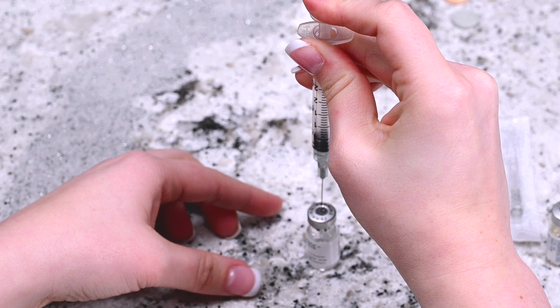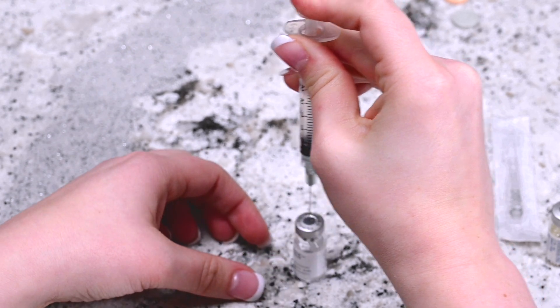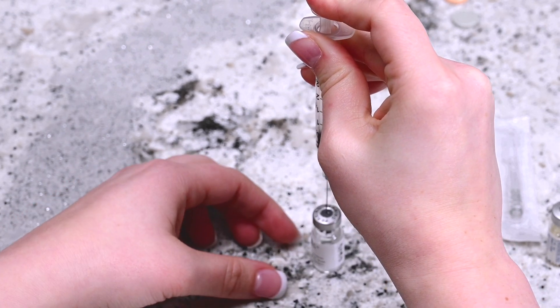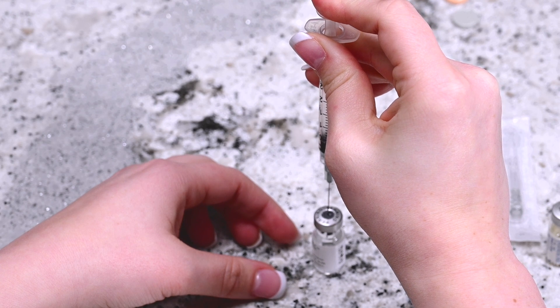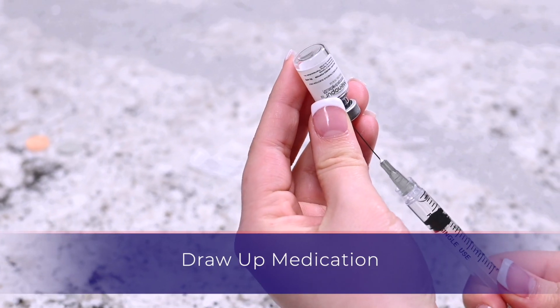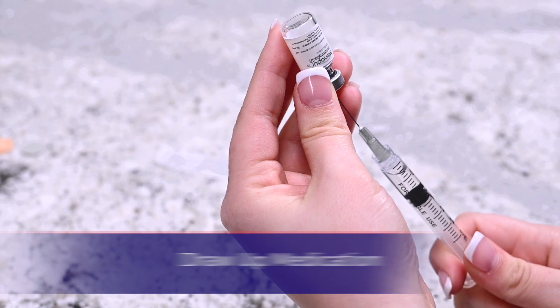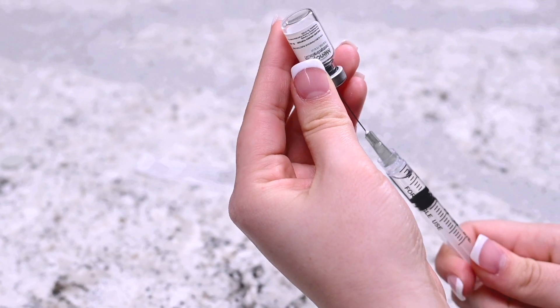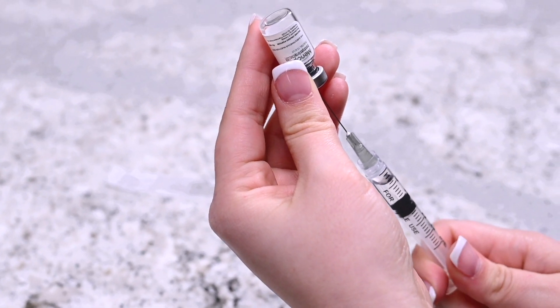After releasing all the liquid into the second vial of Menopur powder, gently mix the contents until the powder dissolves. Do not shake the vial. Invert the syringe without removing it from the vial and pull the plunger back until all the contents from the vial transfer to the syringe.